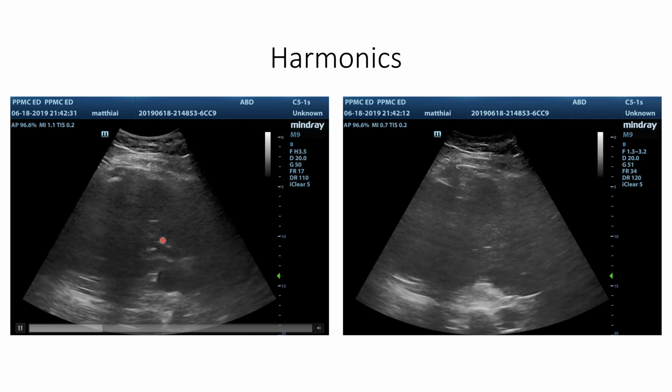So when you're having challenges penetrating deep enough in a patient with a lot of adipose tissue, steatotic liver, etc., turning the harmonics off is an option. Now, it's going to make your resolution, especially in the near field, worse. But with the harmonics, I can even see some probably hepatic vein there. But if all you care about is seeing the IVC, then who cares what the resolution of this junk is up here, especially when you can't even see it anyway because the patient's such a challenging habitus.